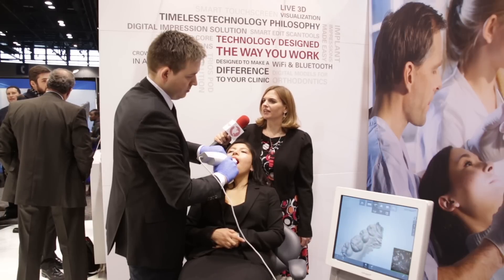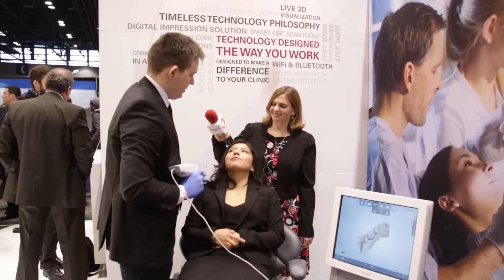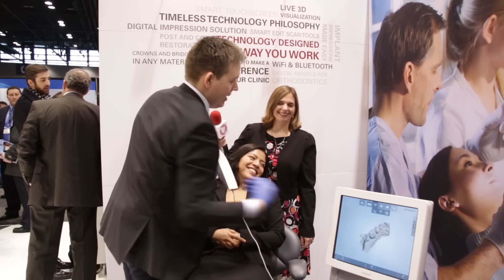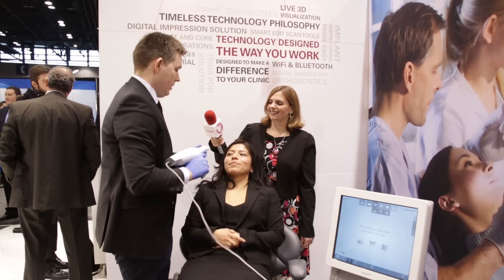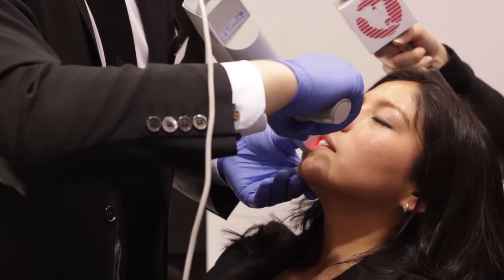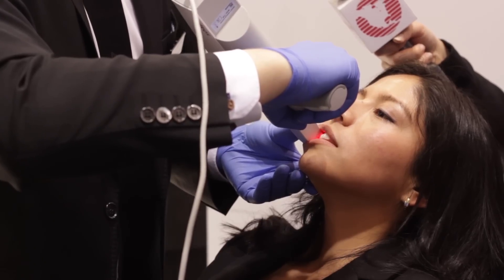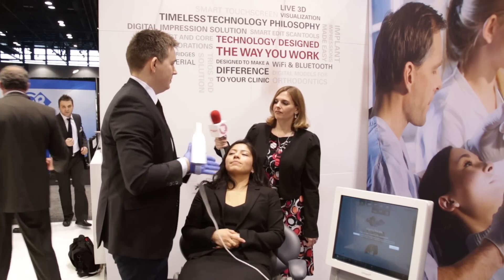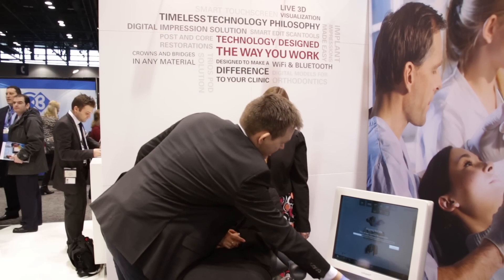And this provides more comfort for the patient, is that correct? I hope so — what do you say, Nancy? Definitely. Great. And now for the bite — we tell the patient to open up and bite, and then we get a maximum of five seconds for the bite, one swipe, and then we're good to go. And it's as easy as that.